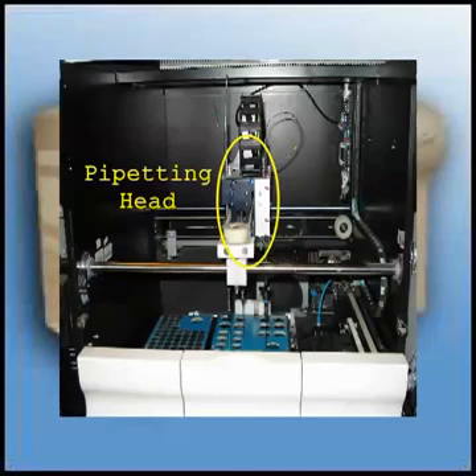The front plexiglass cover lifts up, allowing you access to the pipetting head, arm 1, and the inside of the unit. The unit will shut down unless the service disc is in the floppy drive or the door safety switch is bypassed.